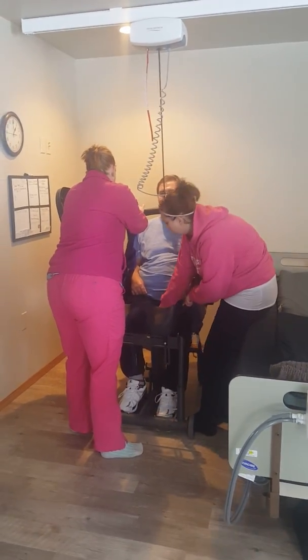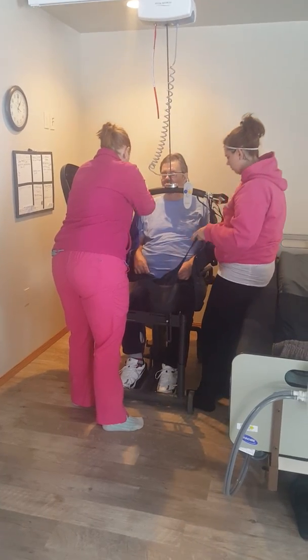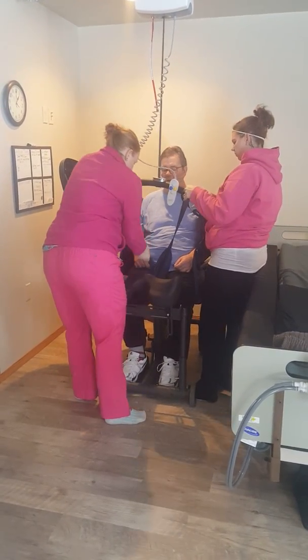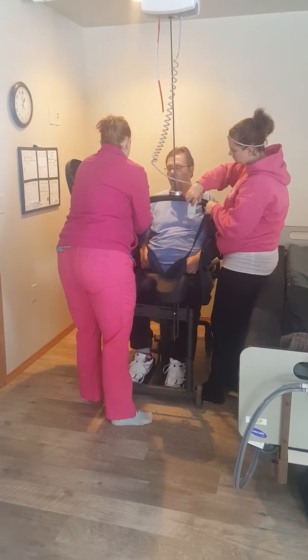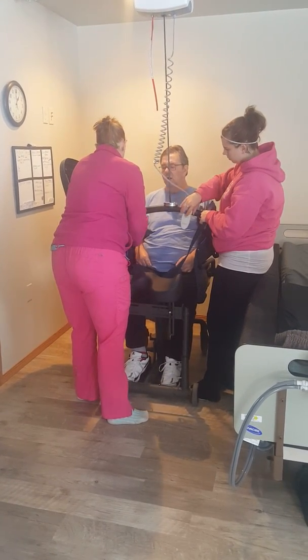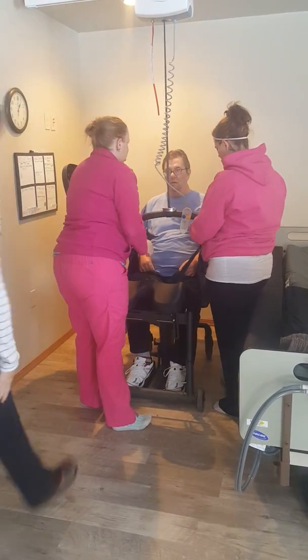As a reminder for those watching the video: he always needs his tennis shoes on and tied. Check the catheter bag to make sure it's pretty much emptied before the half-hour to hour treatment. Also make sure that the catheter tube is not interfering with the knee pad.